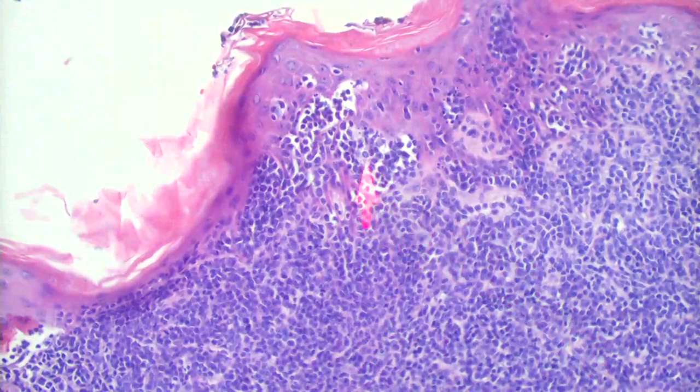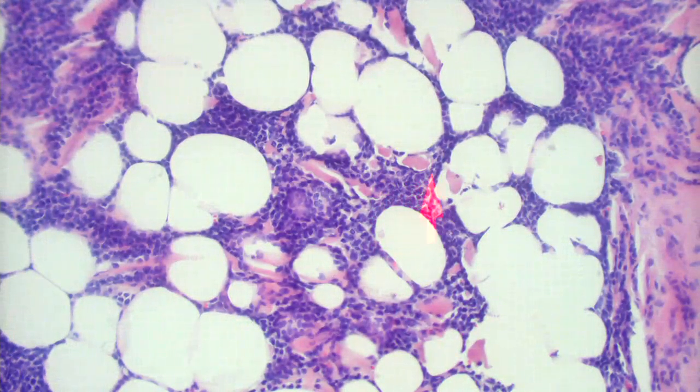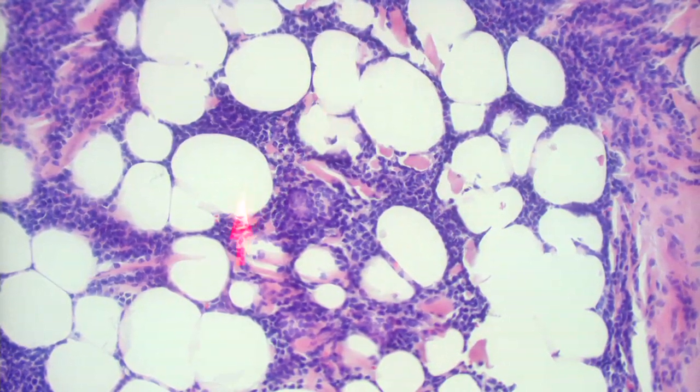It still has some epidermotropism in here. Sometimes when you get MF in the tumor stage, it loses the epidermotropism. It also loses the epidermotropism in Sézary syndrome. The other thing is that these subcutaneous T-cell lymphomas, when you get this involvement of the fat like this, that's more commonly seen with T-cell lymphoma too. Doesn't have to be. You get B-cell lymphoma down in here also, but when you see this rimming, that favors T-cell lymphoma.